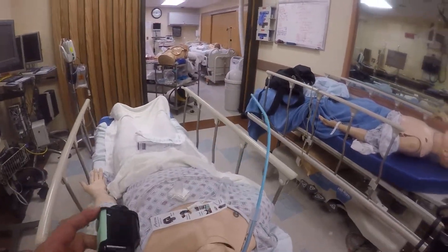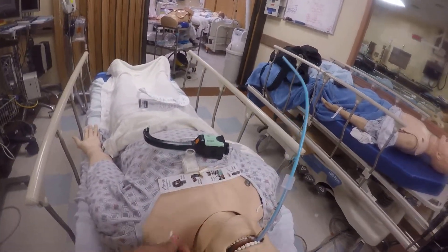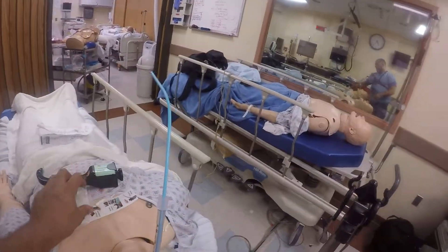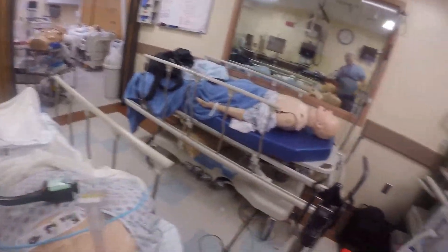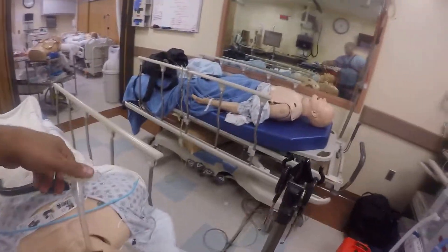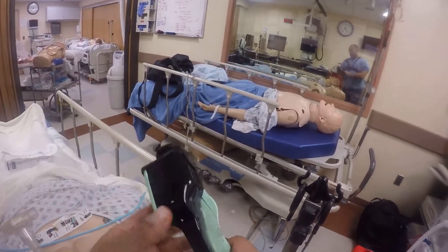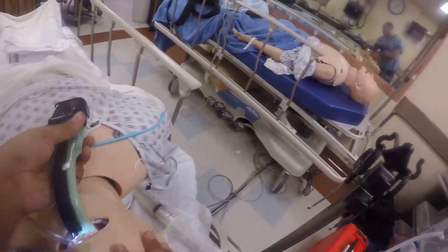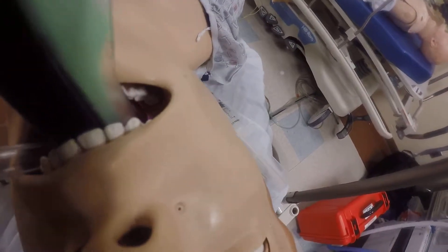There's passage. You do routine — inflate the cuff, secure with tape, put a capnometer. There will be people who won't believe that your tube is in. What was the lesson I recently taught? Push it to the left of the mouth, turn this on, and use it to visualize that the tube is in.